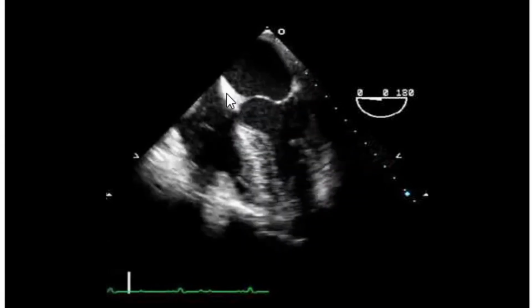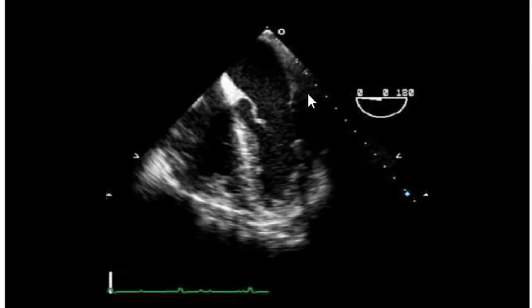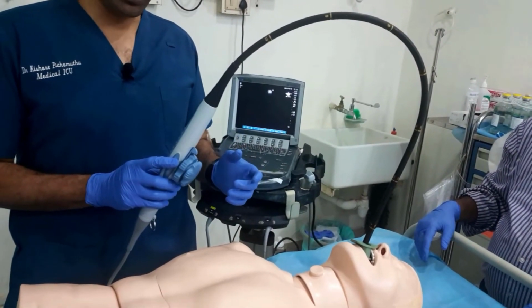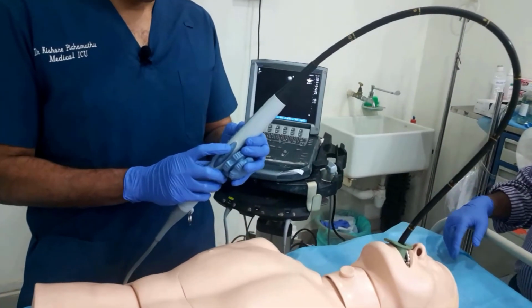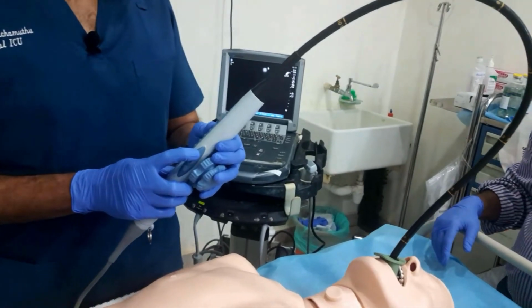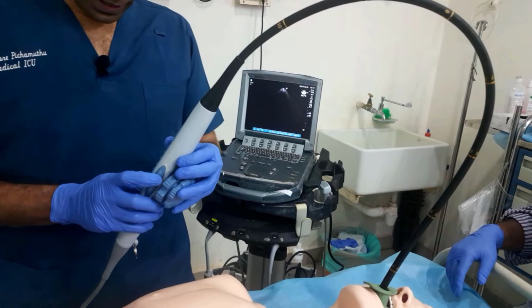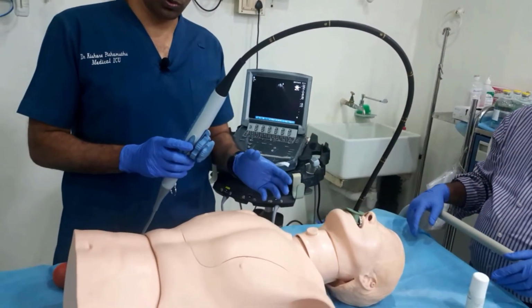You can also assess atrial septal defect and pericardial effusions in this view. Okay, after we've seen the mid-esophageal 4-chamber view, we can then make a small adjustment in the angle of the beam. We take it up to 120 degrees, and this brings us to the mid-esophageal long axis view.